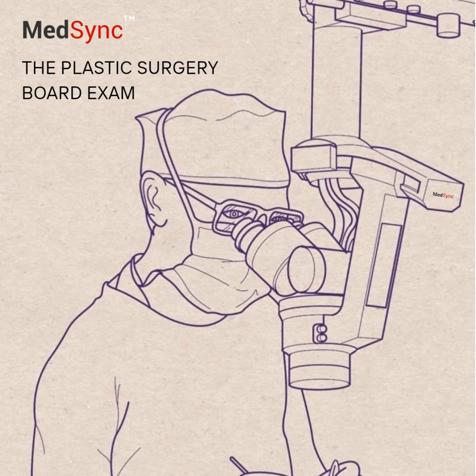Hypothesized advantages include maybe less blood loss, the collagen tightening effect, and potential use in difficult fibrotic areas. Disadvantages include longer operating time, equipment cost, a learning curve, and the risk of thermal injury or burns if not done carefully. Okay, let's talk complications across all these applications. What are some common or important ones?